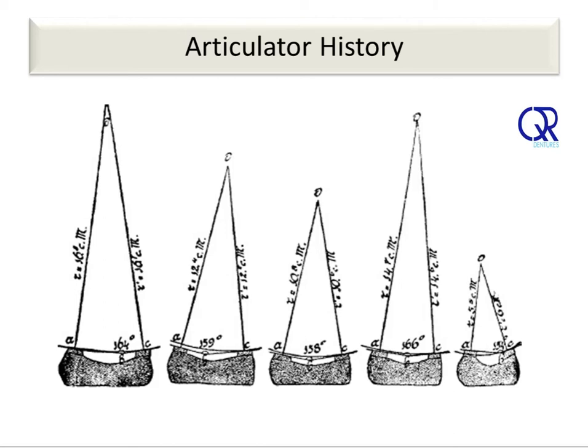Furthermore, Frank suggested that it was evident that the directions of the natural masticating surfaces differ so greatly from those obtained by repeating the experiment of Christensen that this experiment entirely fails to prove the correctness of the Christensen articulator. Bernard Frank's rhetoric was that of a man with a mission, to let the world know that it is utterly impossible to solve the problems of articulation by means of articulators.